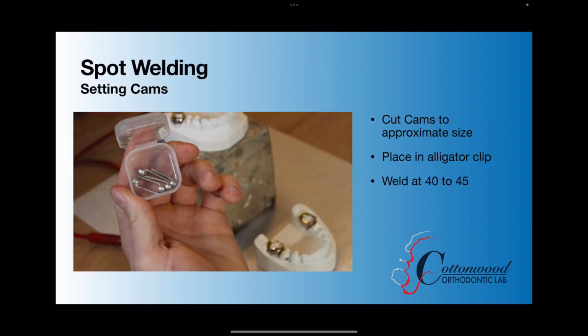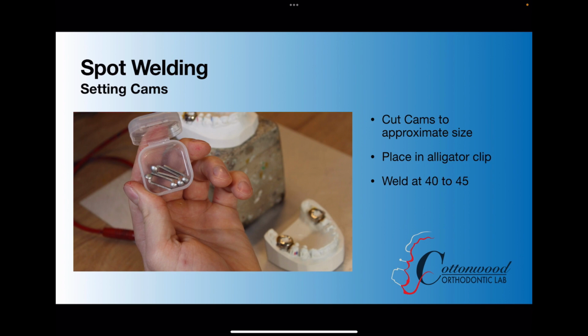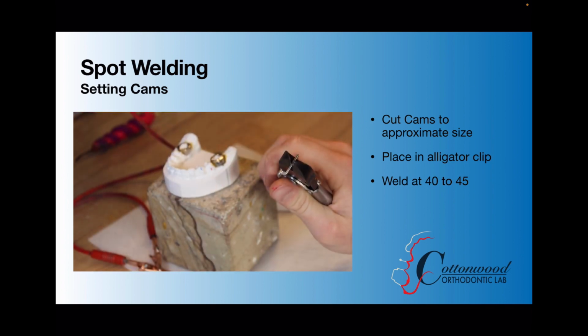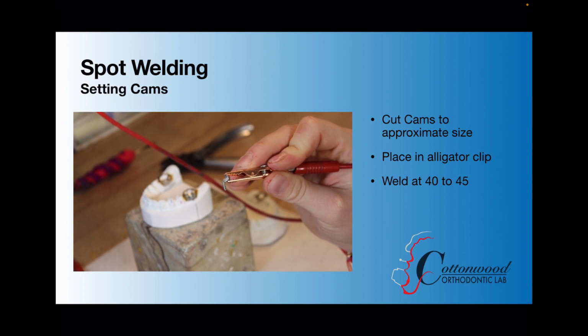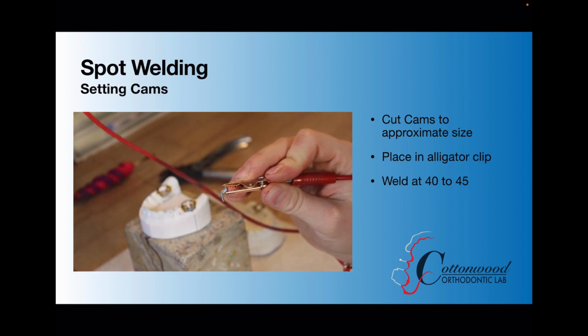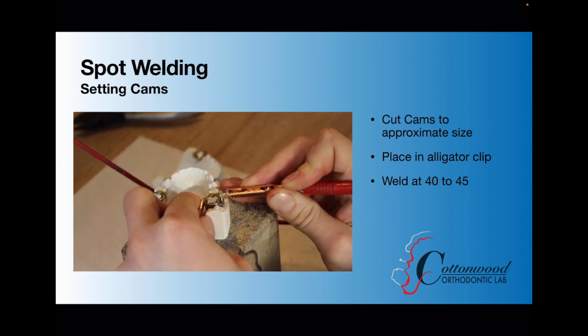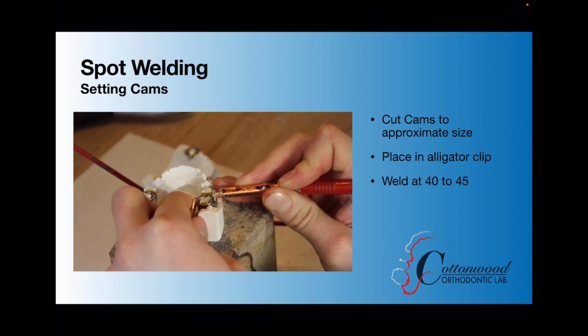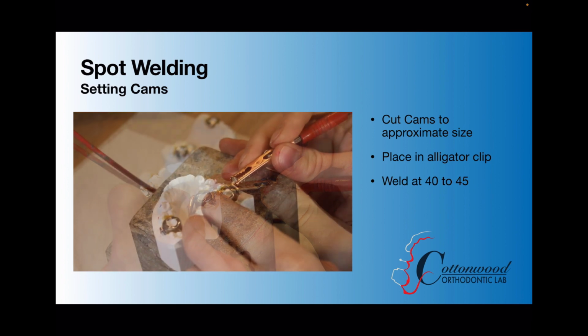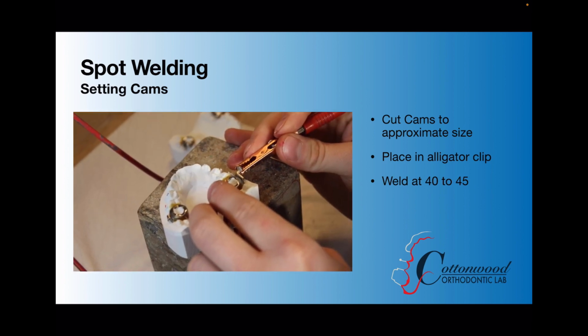Okay, so you're going to start by cutting the cams to an approximate size. Leave a little extra length. You want to be able to move this 2 millimeters anterior or posterior in order to make sure that you can adjust your advancement and make sure your midlines are in place. Once again, we're using our alligator clips to help place these, and our spot welder set to 40 to 45.